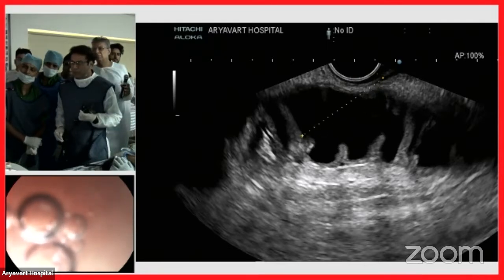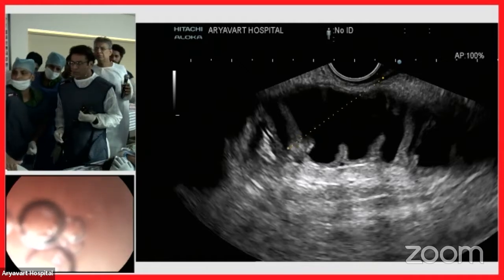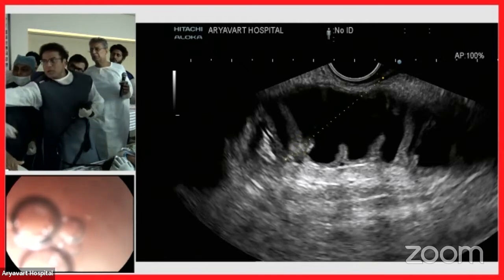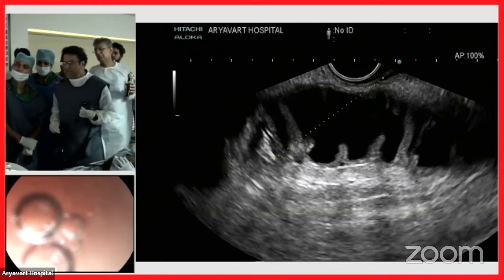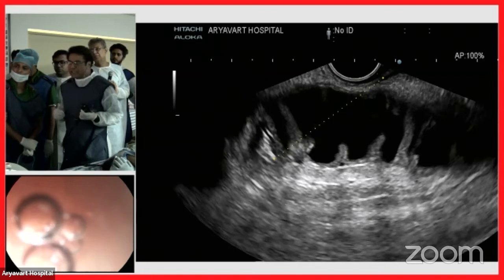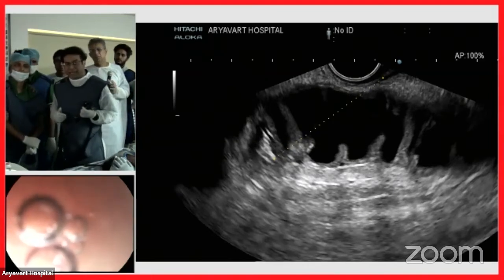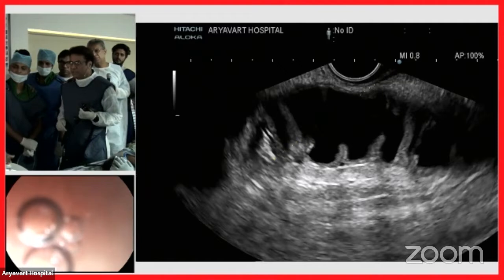Oh, further below. Yeah. Okay. So this is around 3.3 centimeters. I definitely need a centimeter more to be certain that my delivery catheter goes in deep enough. So just defreeze this. Okay.